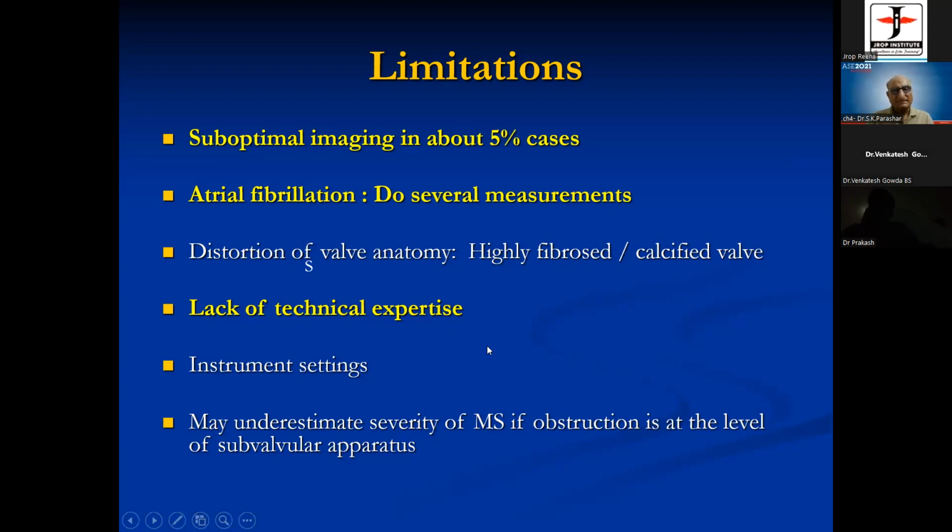Another limitation is lack of technical expertise. So what I always tell our candidates is that even in a normal patient, try to calculate a mitral valve area. Only then, because when you really want to calculate it, you will not be able to get it. So always measure it.